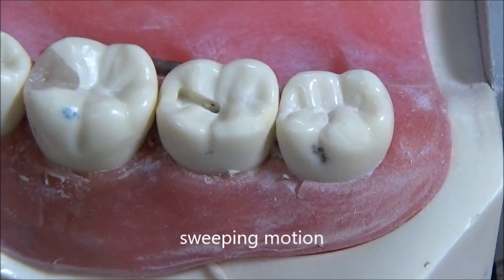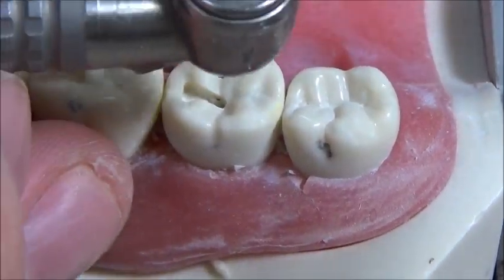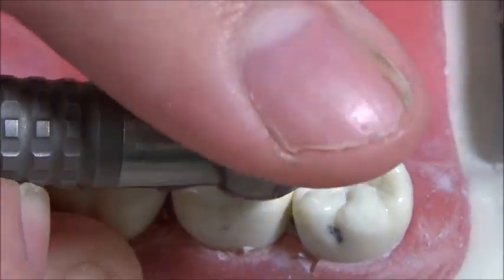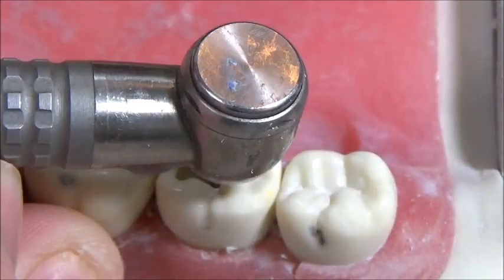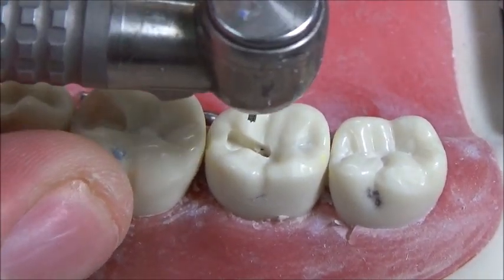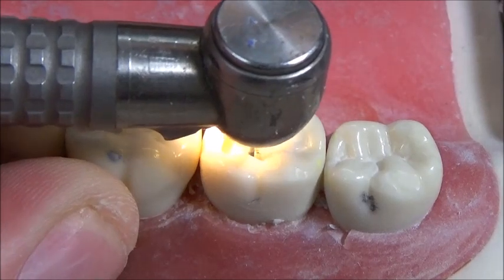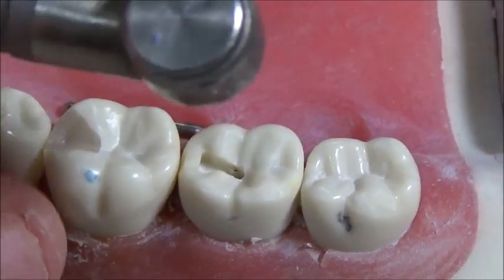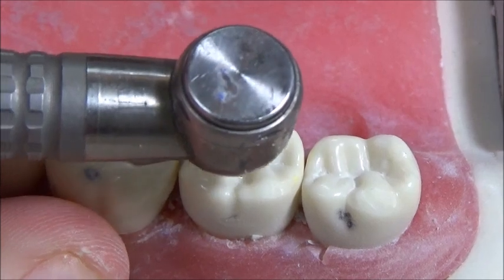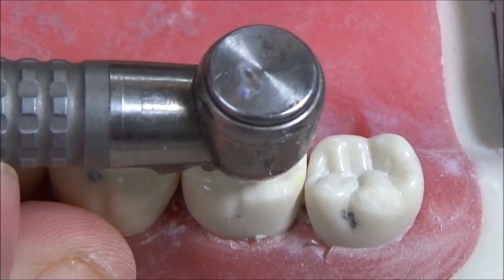As you'll notice, I'm keeping the burr perpendicular to the plane of occlusion here. An easy way to check that is by checking the top of the shank and making sure the angulation of this part of the handpiece is parallel to the plane. I'm also moving laterally up against the wall — not attacking the wall from the center of the prep, but rather shaving away with the wall of the preparation.